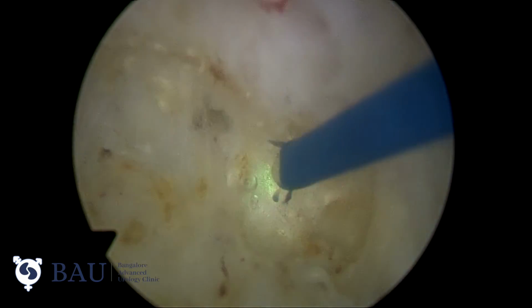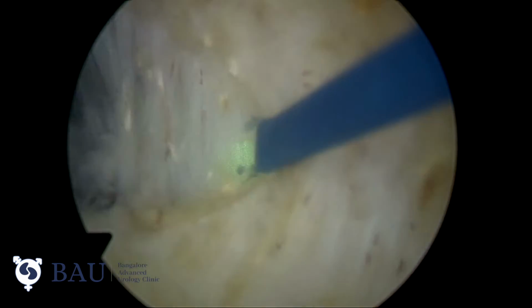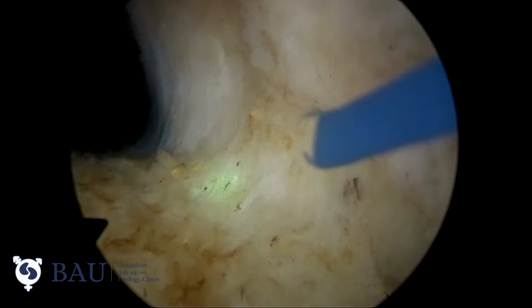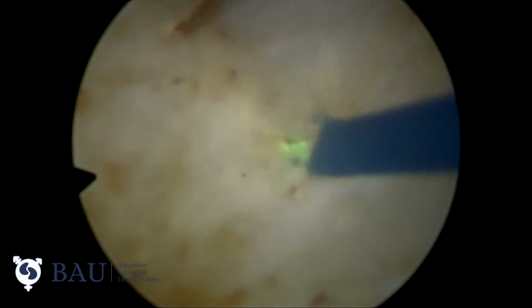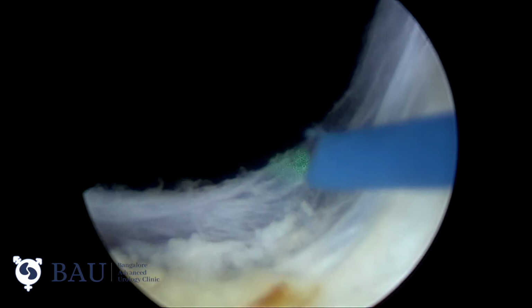Here I had a doubt of entering into the prostatic tissue. Then I went back and reconfirmed the correct plane from the previous dissection. And once we proceed towards the 5 o'clock position, then we can join these dissection lines from the posterior dissection.